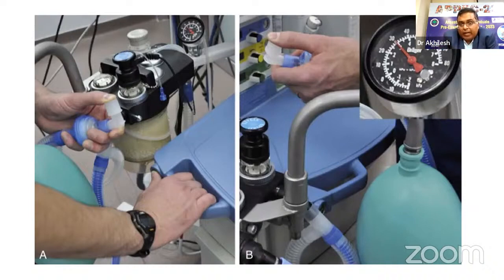What we talked about earlier is a negative pressure leak test. And this leak test cannot be performed in machines which have a check valve, because the positive pressure will go back. So to sustain a positive pressure, it cannot be done in machines which have a check valve.